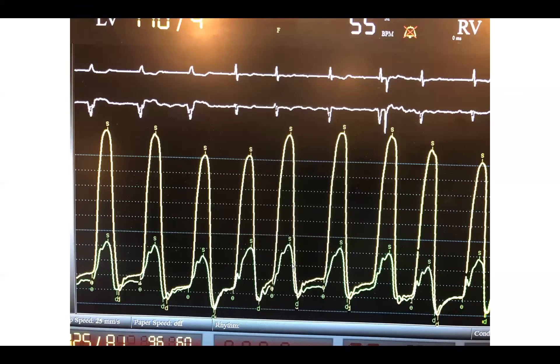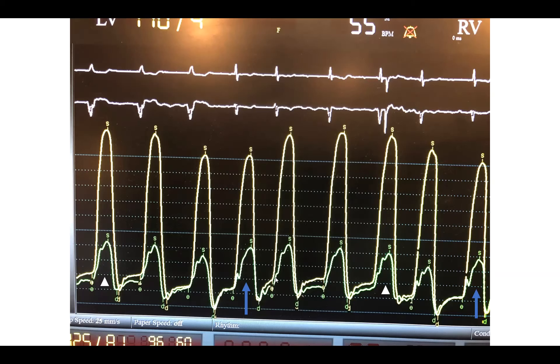Here's another case of simultaneous LV and RV recording. If you look at the peaks, the LV goes down and up, and the RV seems to move simultaneously — it really fools you, it looks concordant. However, you have to take the peak inspiratory beat, which corresponds to that dip, and the peak expiratory beat, as highlighted by the arrows. If you analyze those beats, you see there is discordance: the RV pulse volume is much shrunk between those two beats, whereas the LV is much higher on the expiratory beat.